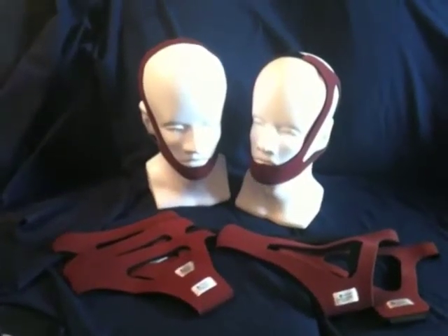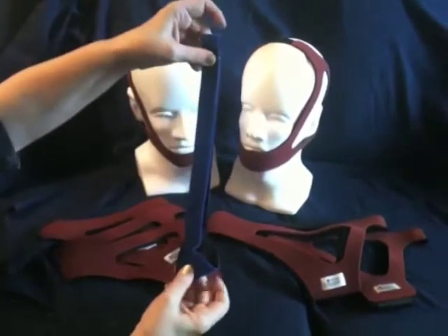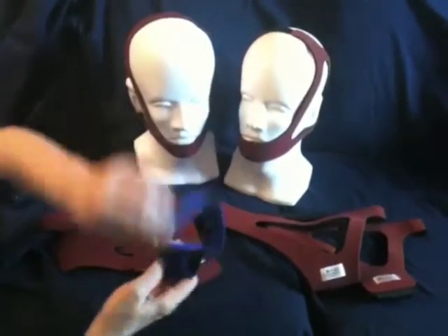Selecting a chin strap, there are a variety of different styles available for CPAP users, the most common being the Simple Strap, which often slips off during the night.